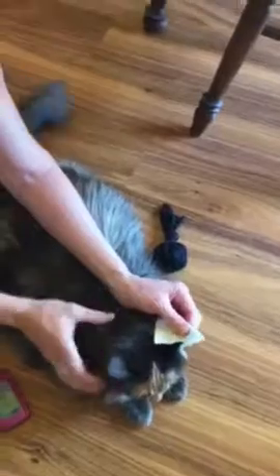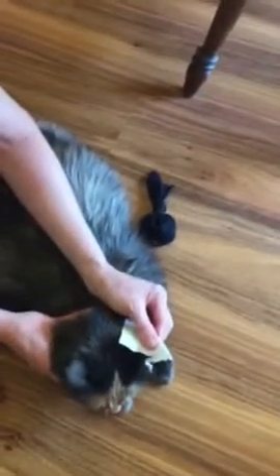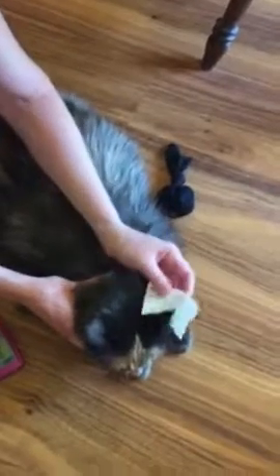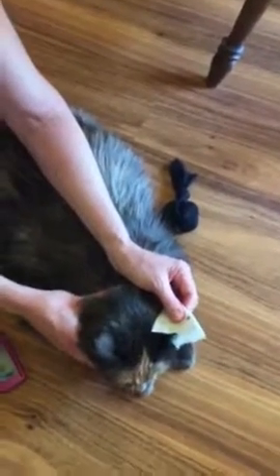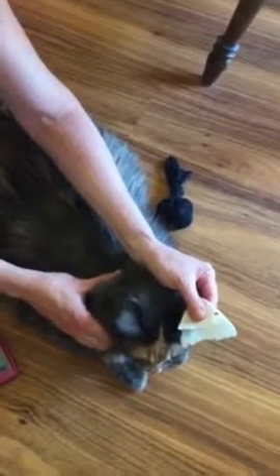I poke again — got blood this time! Now she's borderline anemic, so my next thing is to blot her ear. I always have a little square piece of tissue or paper towel. She's high today — and then I just blot her ear just like this.